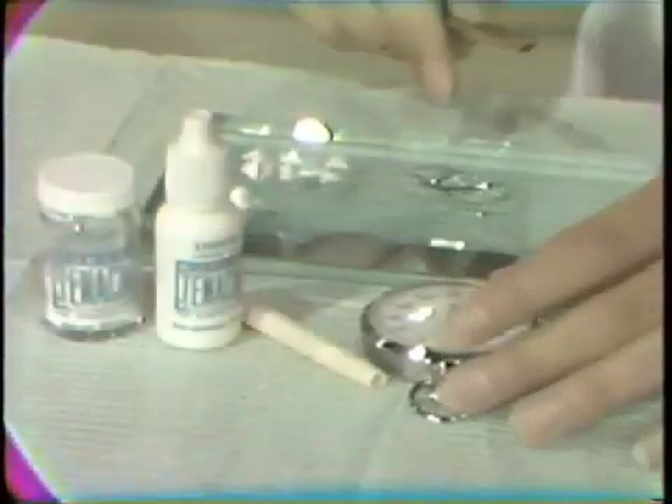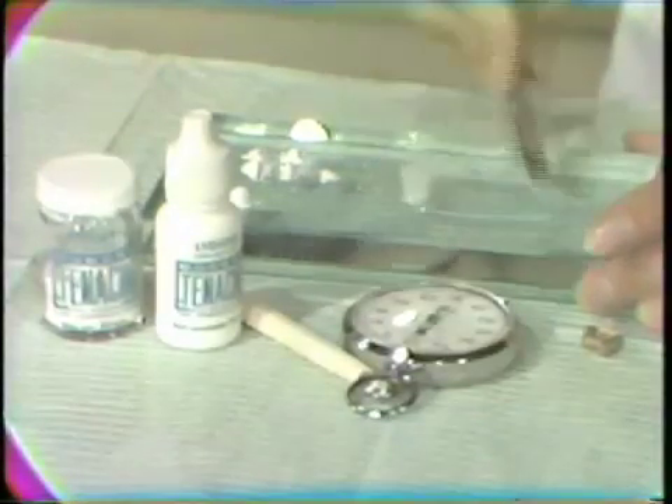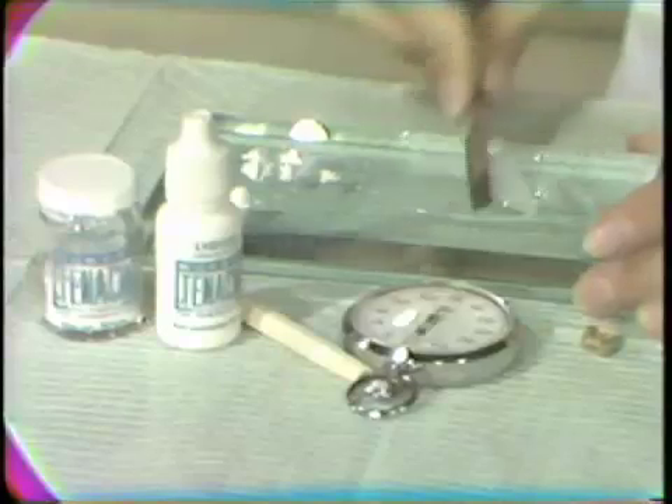Now to the mixing of the cement. The zinc phosphate cement is mixed having placed increments using a measuring stick for the measurement of the powder — one large end and one small end compacted and dispensed onto the mixing slab, with a slight excess in the corner if needed. That powder has been divided into six increments which are added at 15-second intervals, and the total mixing time for this zinc phosphate cement is 90 seconds to bring it to the primary consistency, or so-called inlay or cementation consistency.